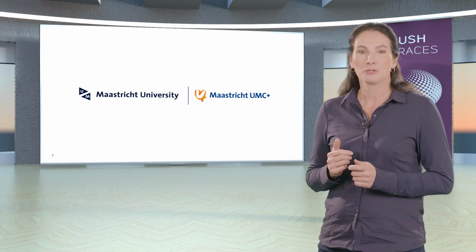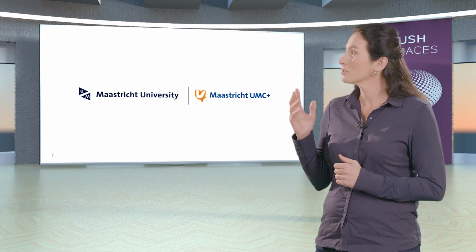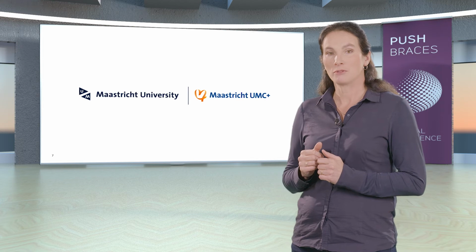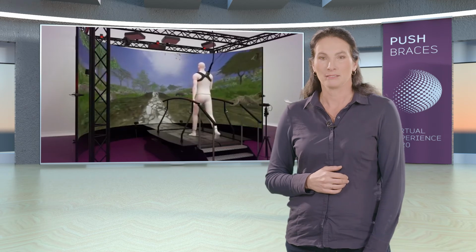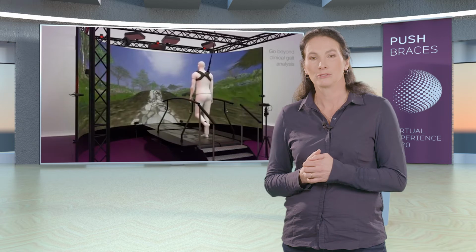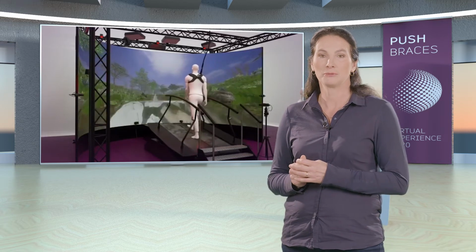We have been able to research these questions together with Maastricht University, who partners with the University Hospital and offers a human movement science program. They dispose of a so-called CAREN setup. That's a state-of-the-art treadmill system that allows a person to walk at different speeds and inclination angles. The video shown on the surround screen contributes towards a natural gait.